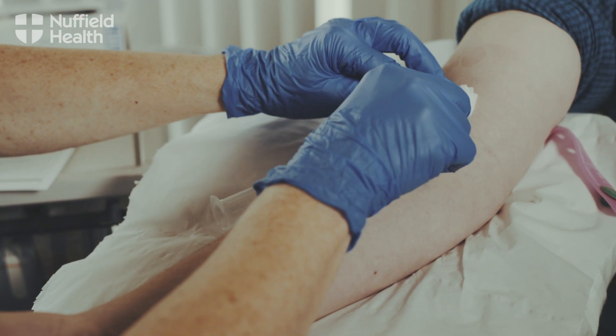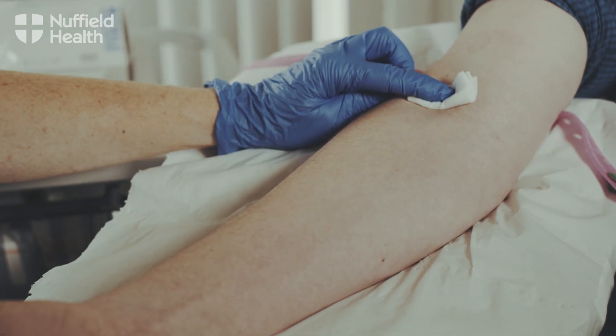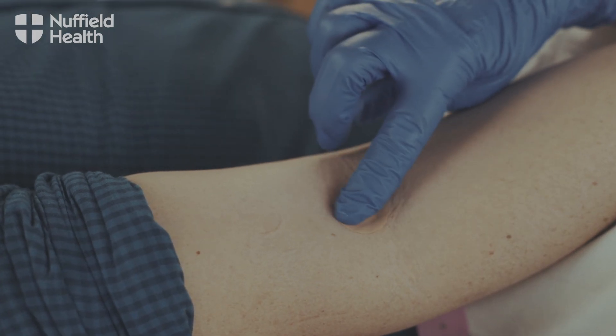At the end of that we release the tourniquet, pull the needle out gently, and just pop a piece of gauze or cotton wool over the top. The patient usually holds that for about a minute just to clot off the vein so that it's more comfortable for them, and then we just pop a plaster on over the top.